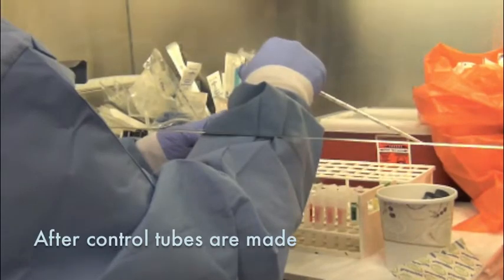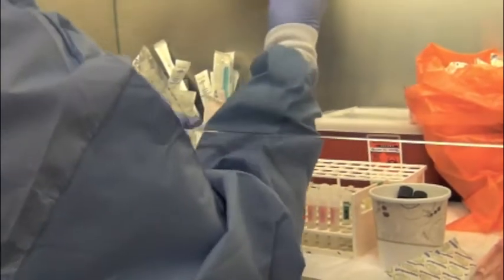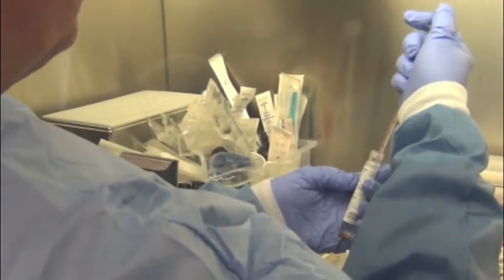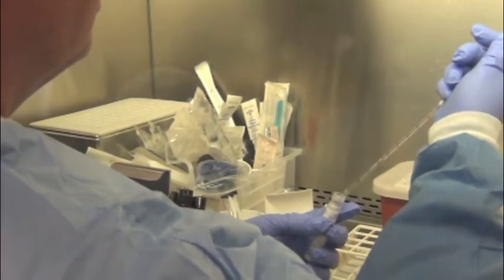Okay, time to add the patient specimens. What I'm going to do now is add 100 microliters, just like we did of the buffers. We're going to add that much to each one of the lysis tubes.